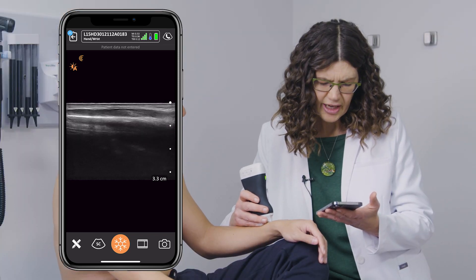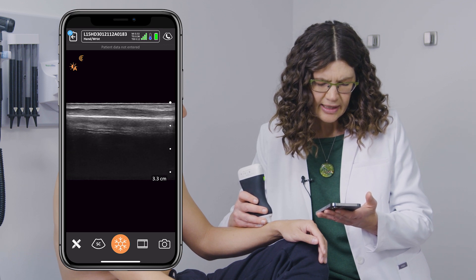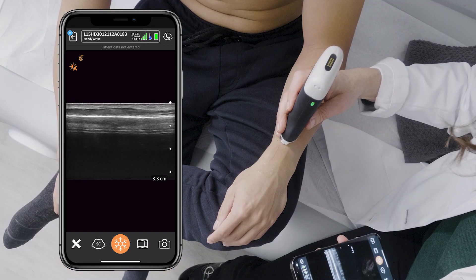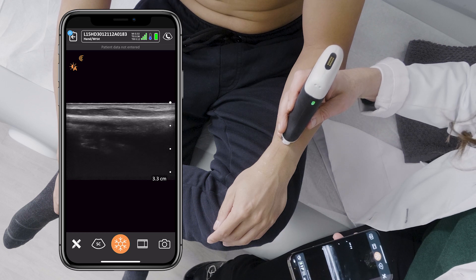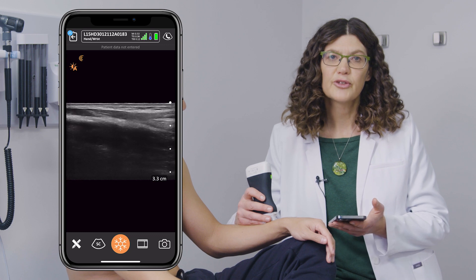If you happen to see a fracture, you will clearly identify it as a break in that bright white line. There will be surrounding swelling, which will be seen as a hypoechoic area. This concludes the ultrasound examination of the distal radius.